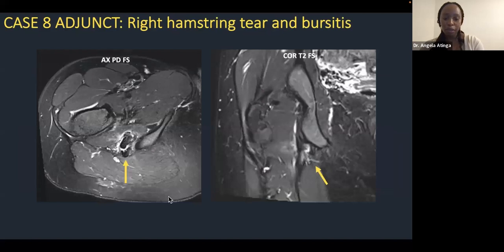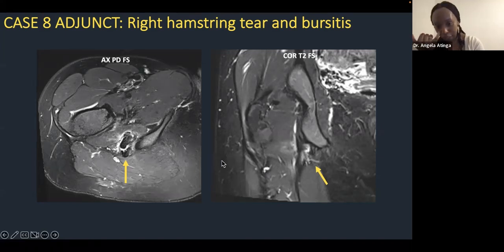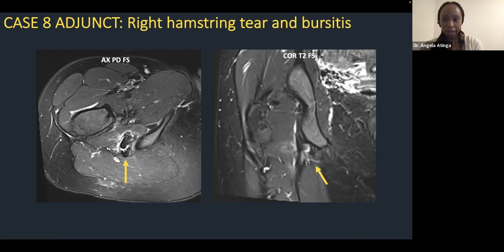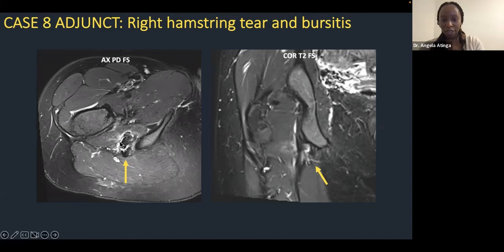Here's a patient with very abnormal common hamstring tendon: fluid is tracking between the tendon origins and surrounding both components. This represents tendinosis with intrasubstance tearing and bursitis. On coronal sequences you can see fluid tracking into the tendon. Note that the sciatic nerve sits very close to the common hamstring tendon, so this pathology will be causing irritation of that nerve.